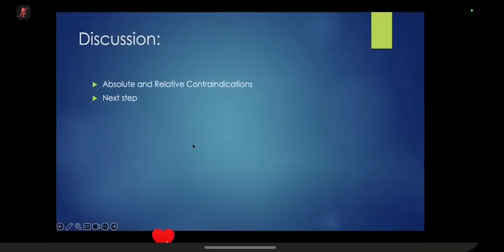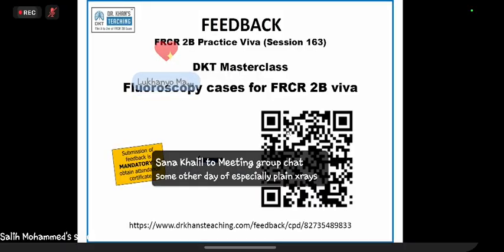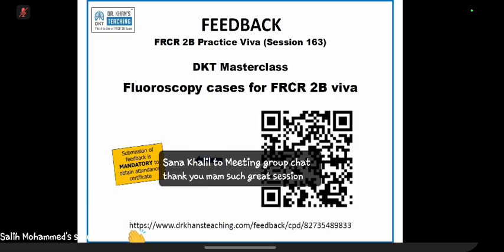You might not get the fluoroscopy malignancies because the UK is moving to other investigations. Like they want to do the CTs, they want to do the endoscopies, and mostly things are diagnosed over there. The fluoroscopy is very conventional. But because in the pediatric setting especially, we are still looking at a lot of cases which are coming in the Viva sessions, that's why I arranged this session.